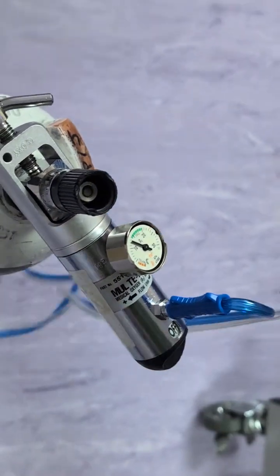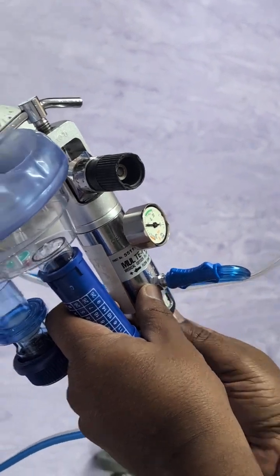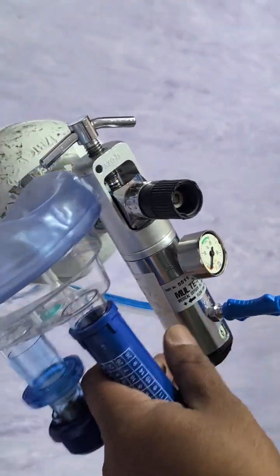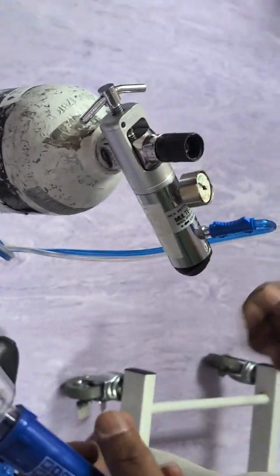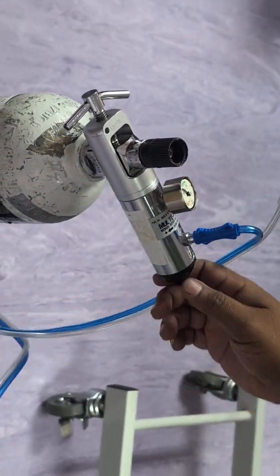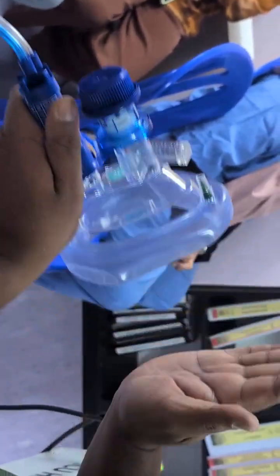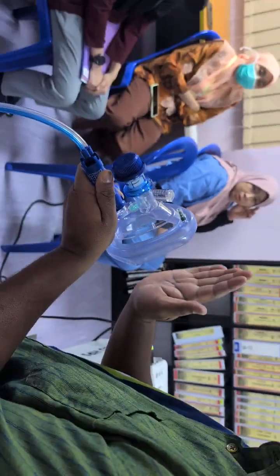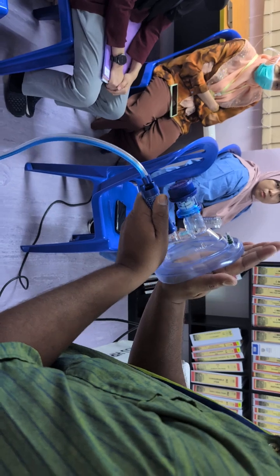Now, when we put this in, I don't have a 7. I have a 6 and an 8 here, so I'm going to put an 8. When I put an 8, you guys see the manometer. The PEEP I've left at 5. When the patient breathes, you see the manometer going up and down. This is the actual PEEP which the patient is getting.